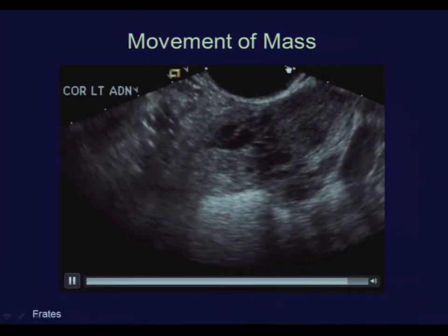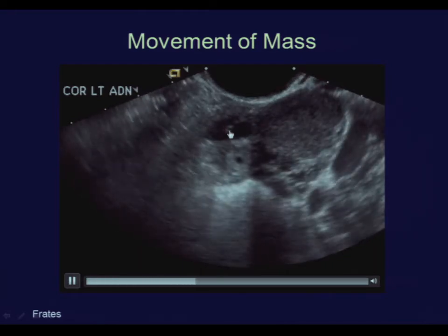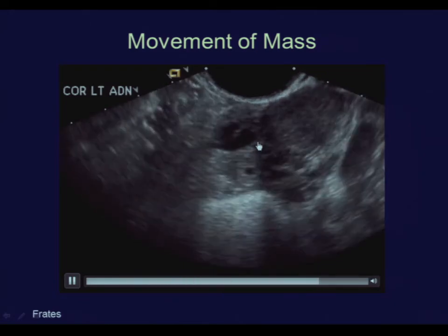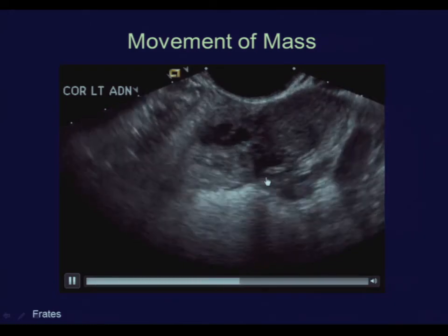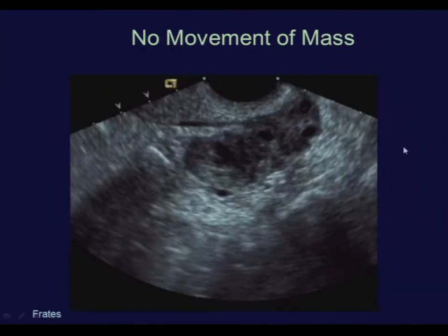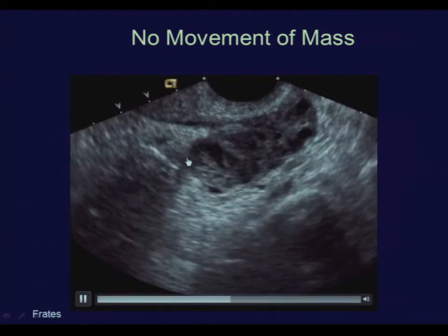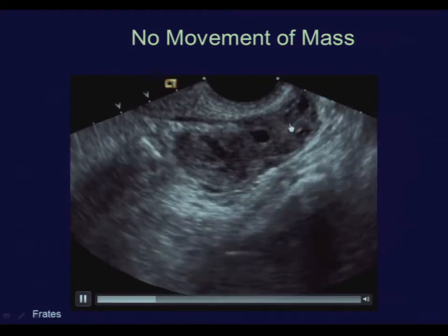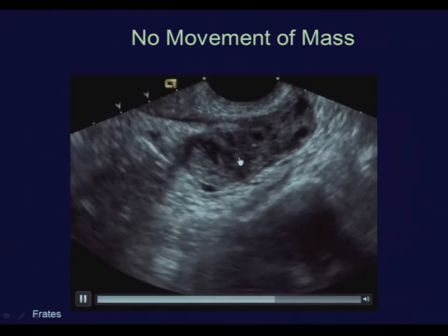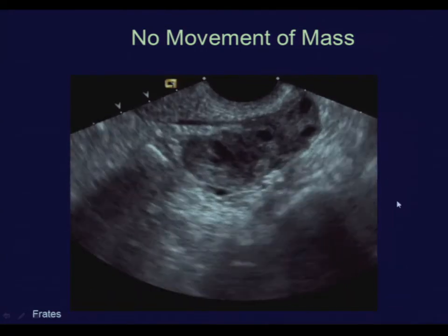So when we push on this patient, the ovary stays pretty still, and the ectopic pregnancy can be slid away, and you can see the motion between your splitting those two planes between the ectopic and the ovary. In contrast to this patient, when we push on this complex mass next to the ovary or on the ovary, we cannot split it off. There is no way to pull this off the ovary because it's part of the ovary, because it's the corpus luteum.